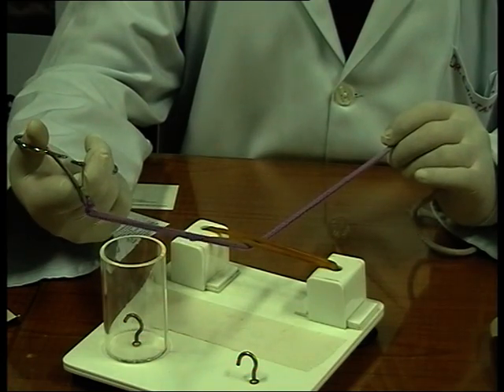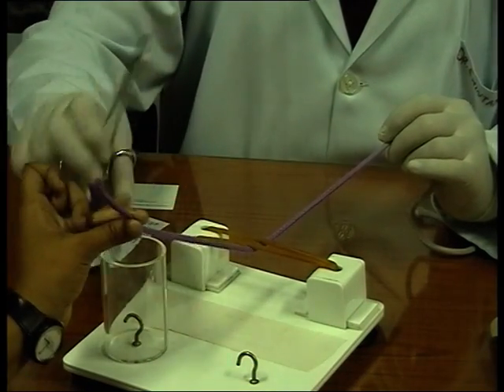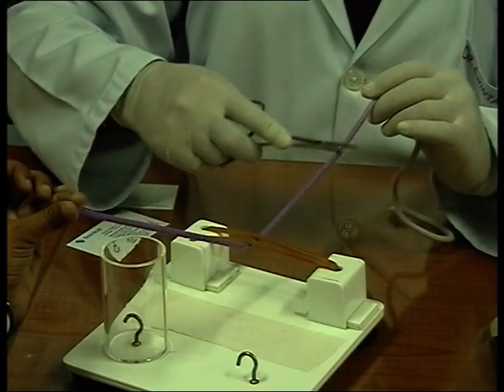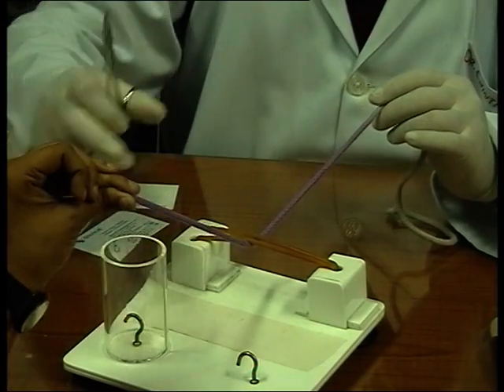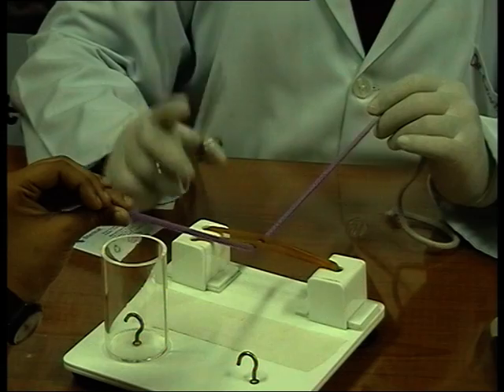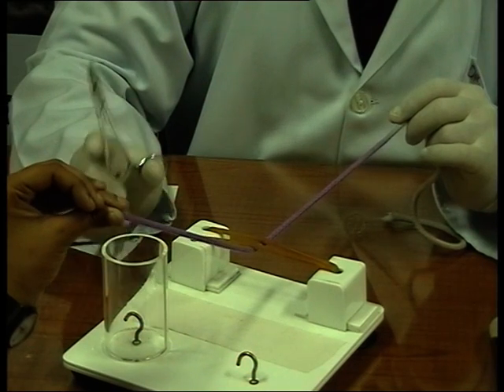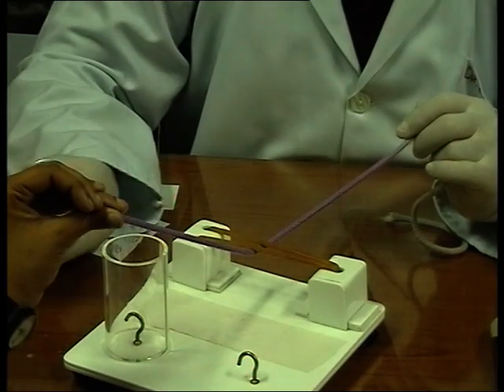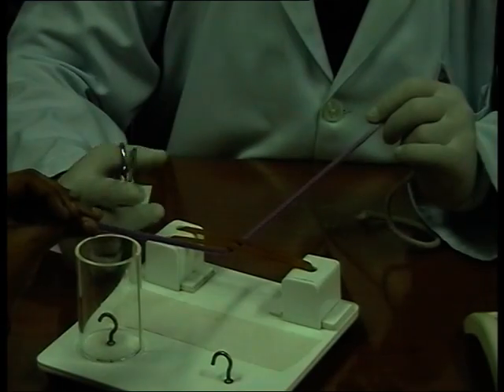Can you hold this, Elisa? Hold the thread with the left hand. Now as you see here, I've gone through the tissue. You form some sort of a V. This V doesn't exist in normal life. You don't expect it to be held that way. But you can imagine a V. And the principle of instrument knotting is you always stay within the V. If you can remember this principle number 1, then knotting is okay. And part 2 of the principle is that you must cross your threads like in any knot. So if you stick to these 2 principles, suturing or knotting with the instruments is done.